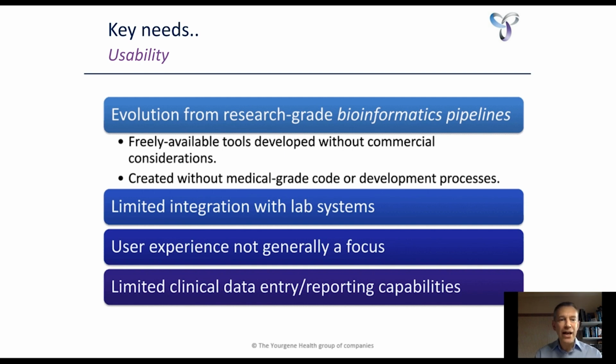So when bioinformatics software really first came into being and started moving into the laboratory, it was coming in from a research environment. So freely available tools had been developed. We have a lot of bioinformatics tools that are contributed to the community with the source code, written mostly in research institutions, and we wouldn't have anything like the valuable contributions that we've had to the field, and it wouldn't have been possible to develop a lot of the workflows and the tests that we have done without those.